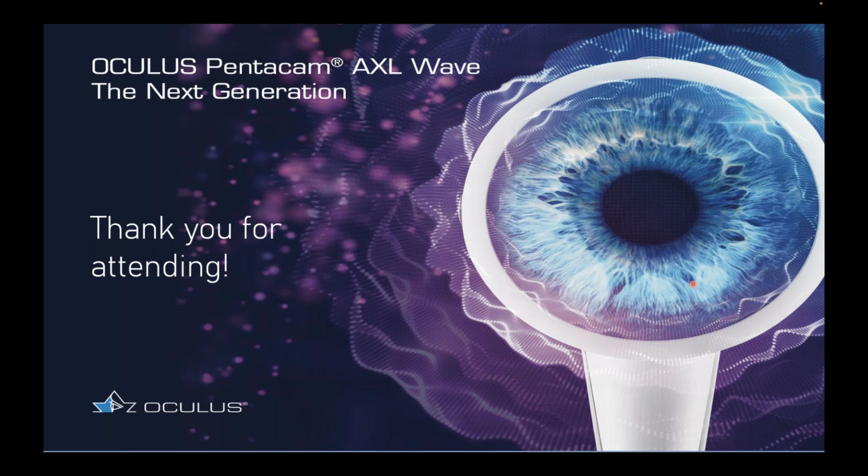You know, here's the truth. If I knew that the lens I was fitting them with fit them really well, very stable, no rotation, no movement, just locked in, and I know that we're getting better all the time at making that happen with the freeform options and the more sophisticated designs, I think that in 5 years, if I had a lens that I knew would center well and be rotationally stable really well, I would put it on everybody with keratoconus. I'd put it on a percentage of all my patients.